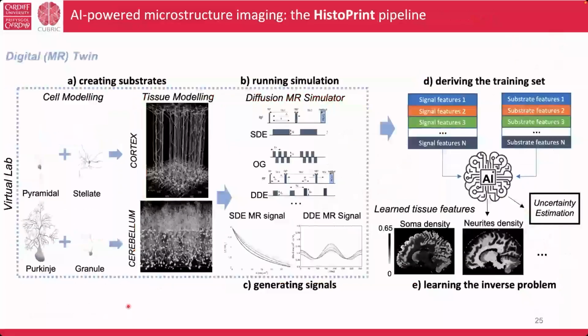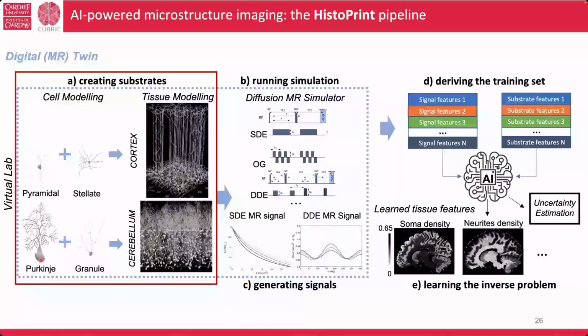Obviously, to address this challenge is not that simple, and you need to work step by step. So first of all, you need to define a better model for the individual cells, rather than 1D graphs embedded in a three-dimensional space, having actual meshes and a generative model that can capture modulation, caliber variation, and all these subtleties that the previous model wasn't encoding.